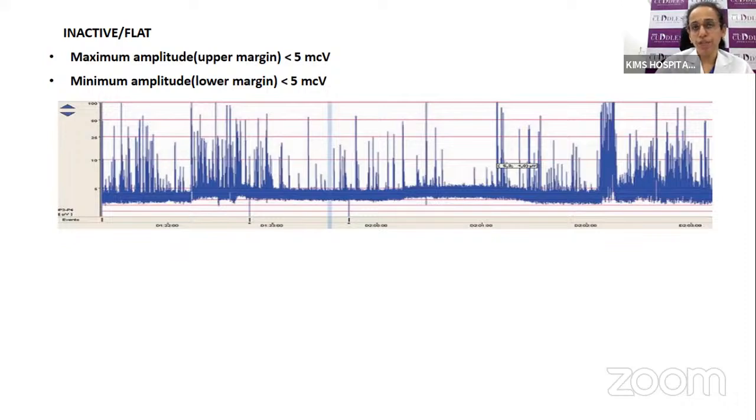So how does this EEG detect the cerebral function? There is always electrical activity happening between the superficial part of the brain and the deep nuclei of the brain, between the thalamus and the cortical areas basically. This difference in the electrical activity between the gray matter and the white matter, between the thalamus and the cortical areas, is detected by the EEG and recorded on the graph.